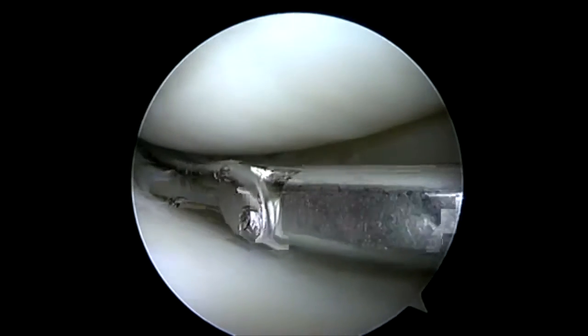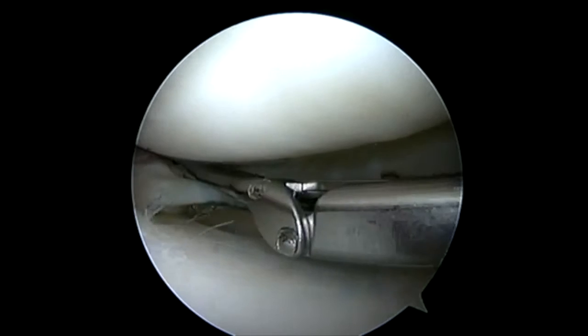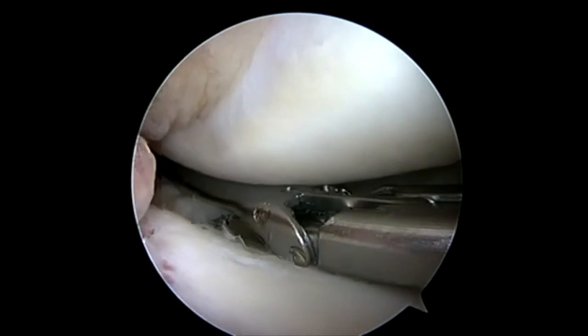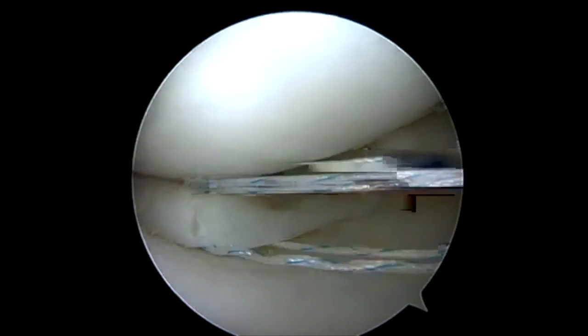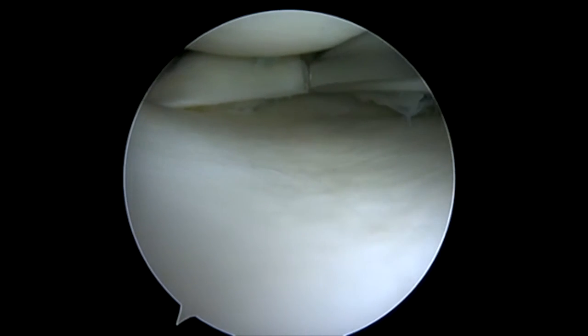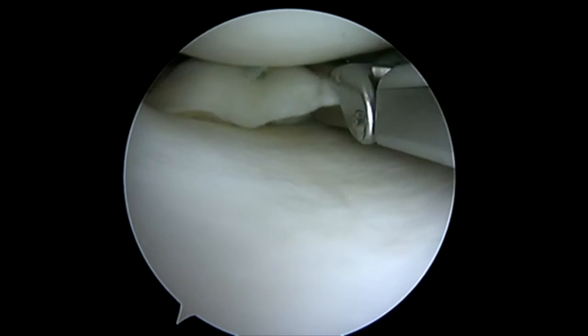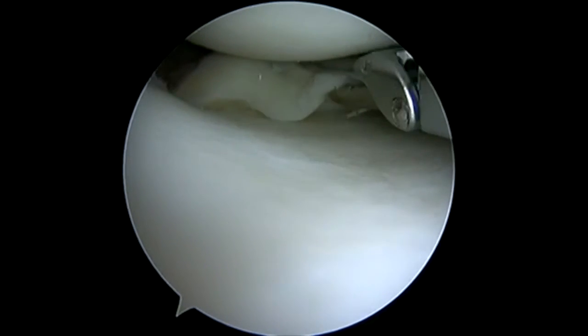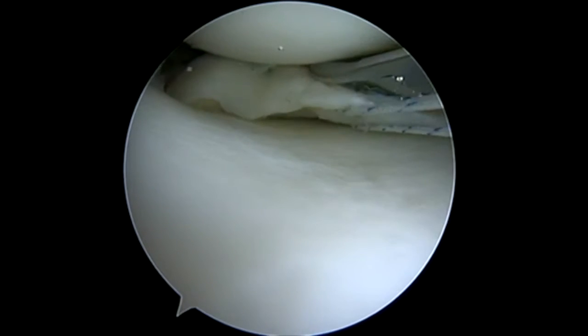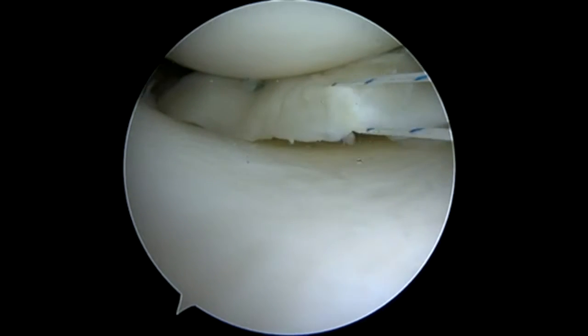We'll pass our far capsular stitch first. Coming back in carefully, we're going to reach underneath our medial meniscus and pass our near stitch. Sometimes if the meniscus tear is really unstable, I will pass that medial stitch first and then pass my capsular junction stitch. We're pushing in as far as we can — you can see we're buckling the meniscus a little — but we're trying to make sure that we get back into that posterior meniscal capsular junction and then pass our more medial pass. You can see how that meniscus flips at us; if I were in the central one third trying a first pass, it would just be inverting the whole time.